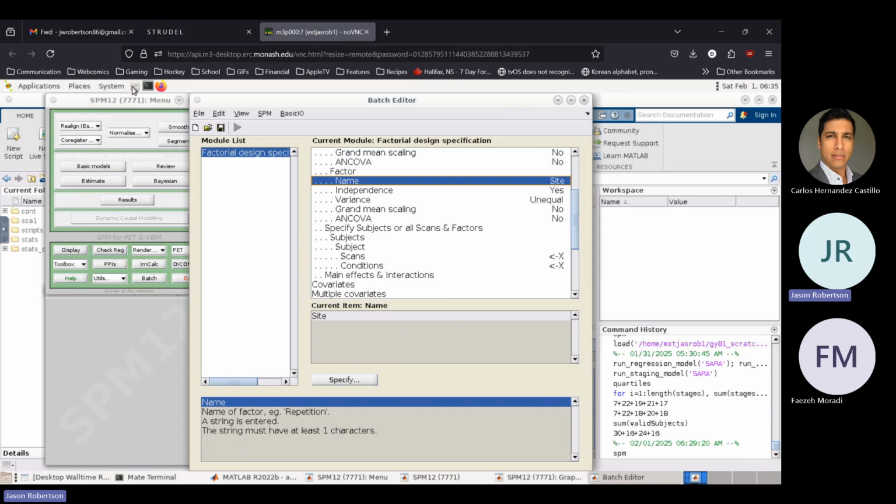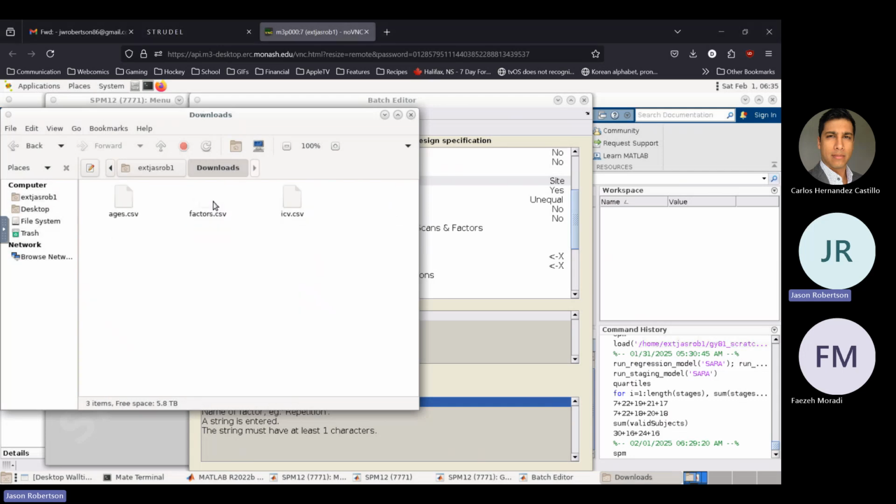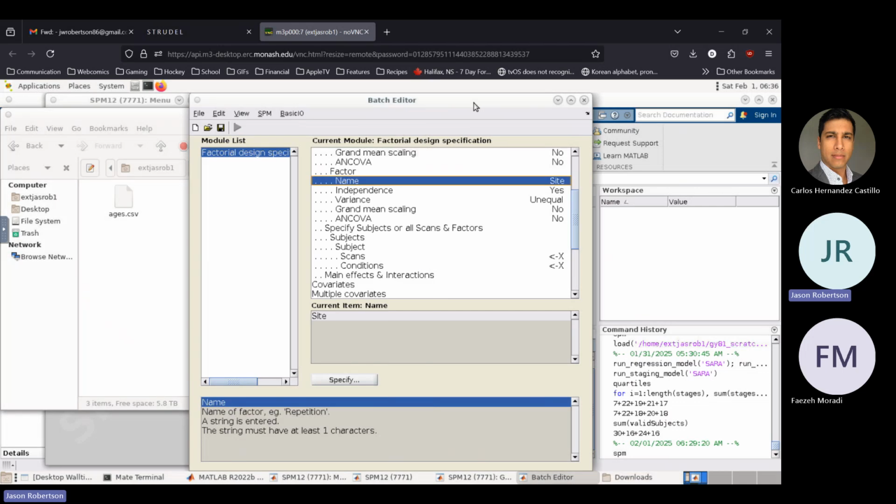And that gives you kind of how the data is, what is the variance of the data for that specific model. Yes, I noticed that it was mostly used for ANOVA. Yeah, because in ANOVA you have different factors and different comparisons, right? You have maybe time and group and the interaction. But the F test will do a comparison across all of them.